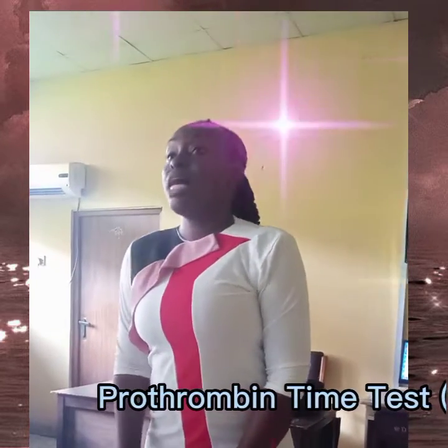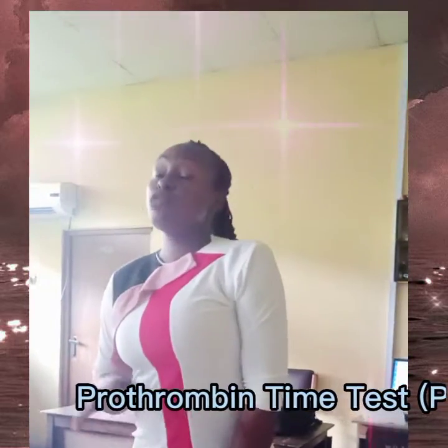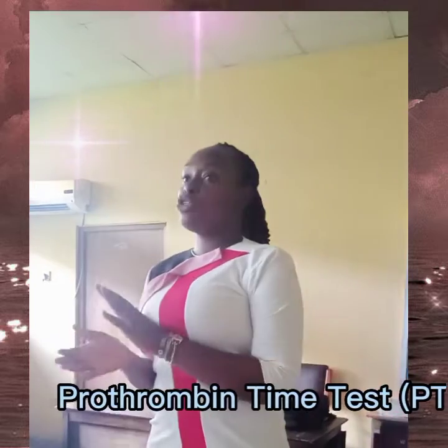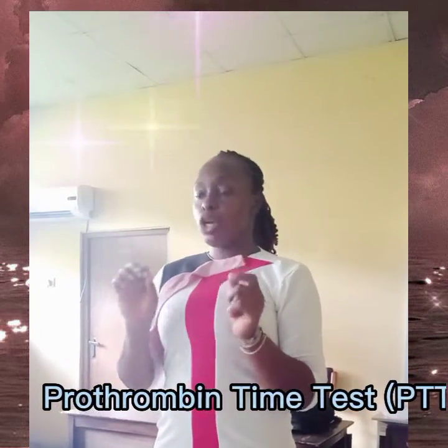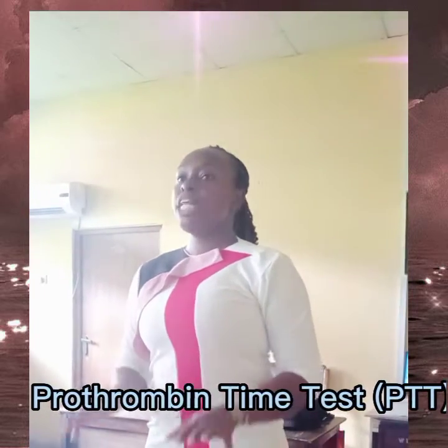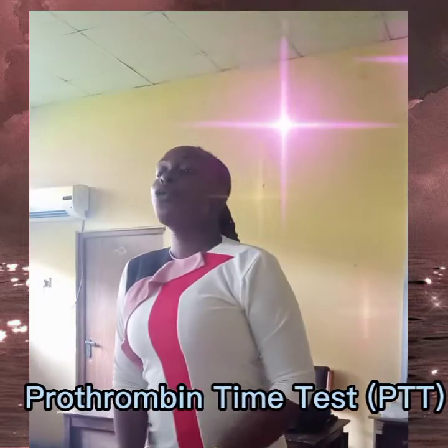When tissue thromboplastin alongside 0.025 mol per liter of calcium chloride is added to platelet poor plasma, when the blood clots, the time is taken as the prothrombin time. So what are the reagents? The reagents used for this test is prothrombin time reagents.